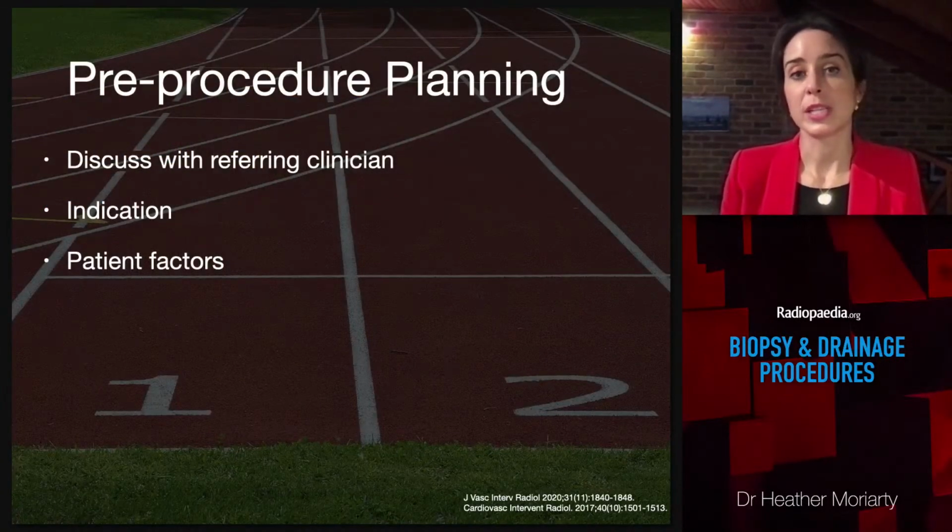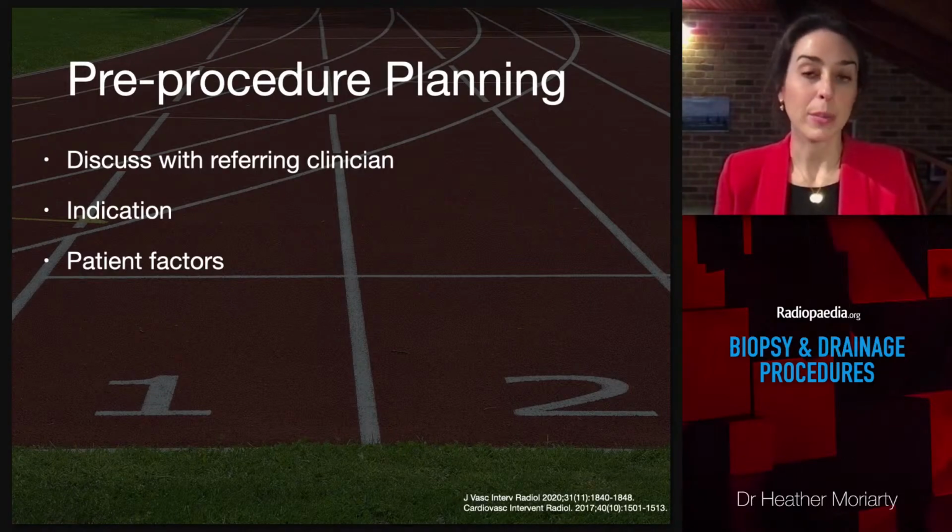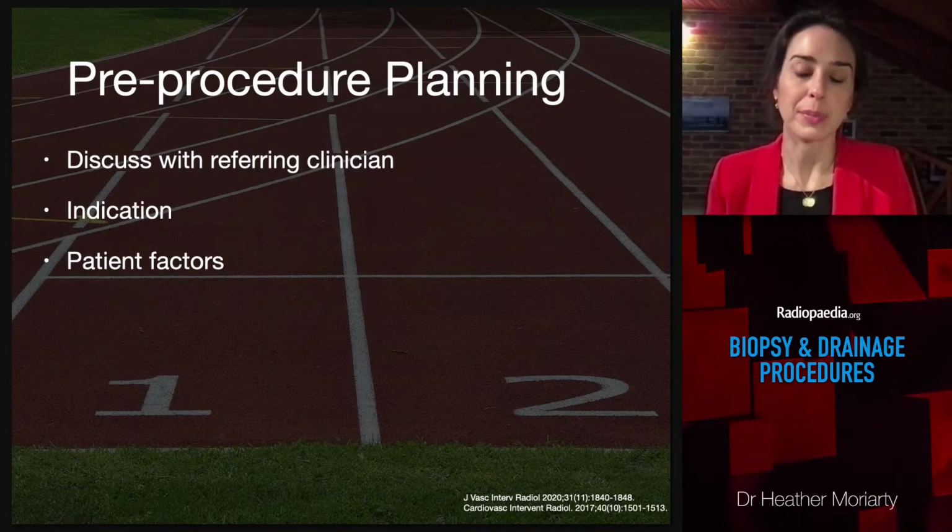So biopsy and drainage procedures are safe and effective procedures. Percutaneous drainage has significantly improved patients' morbidity. Biopsies are key to guide therapy, more and more so in the era of molecular profiling and immunotherapy.